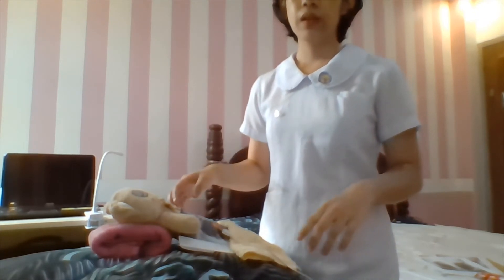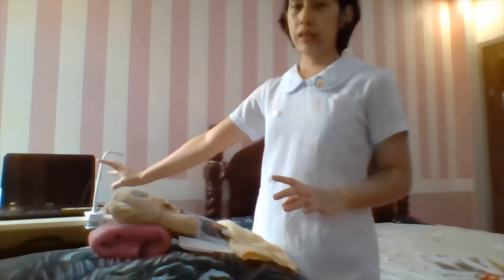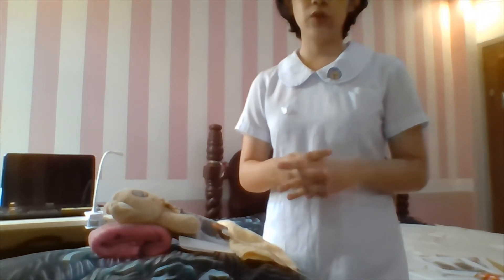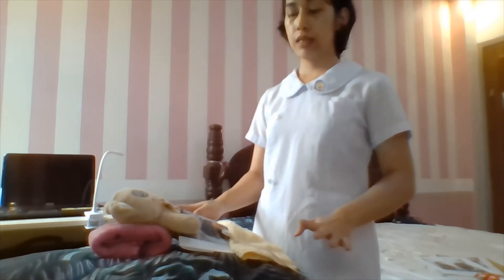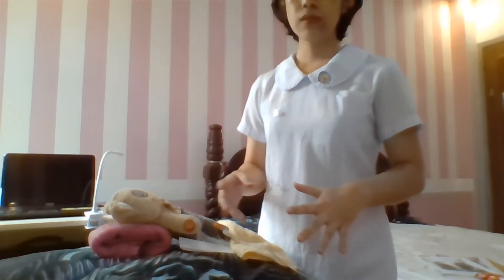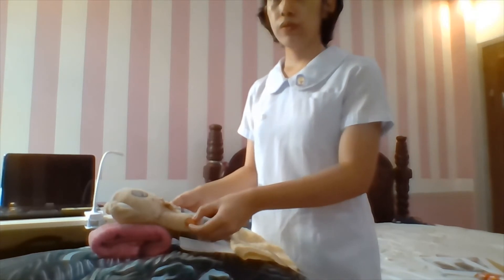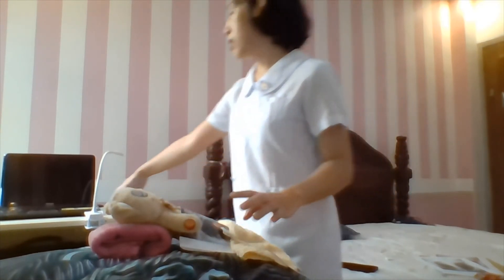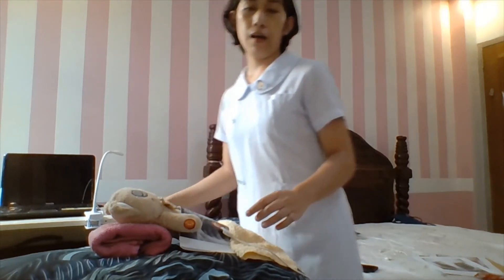If necessary, enter the patient's data onto the machine. Ask the patient to relax to prevent tension, and encourage the patient not to talk as this will interrupt the procedure. Now press the auto button of the machine, as this will generate the results.